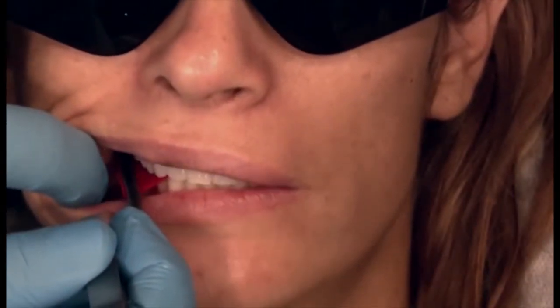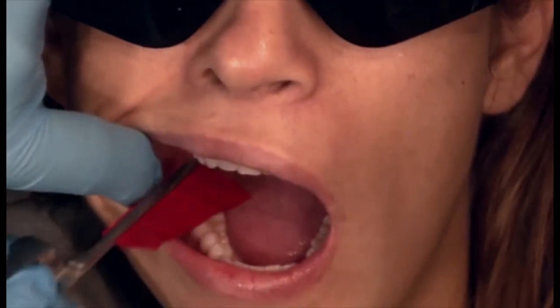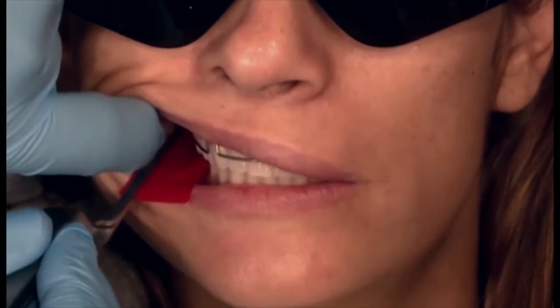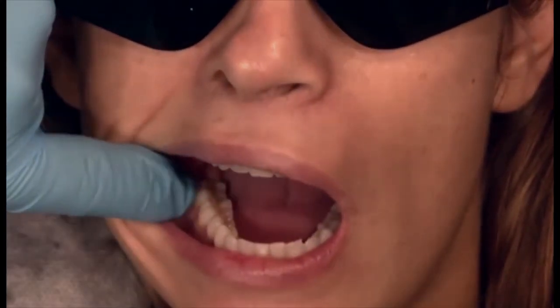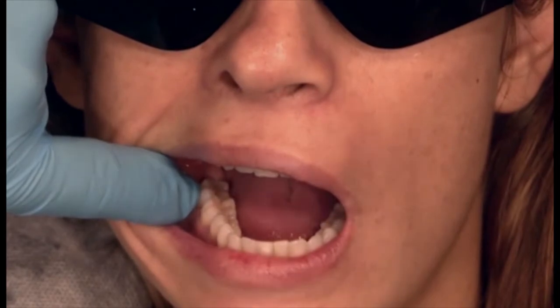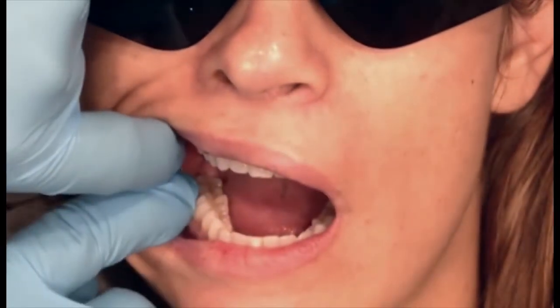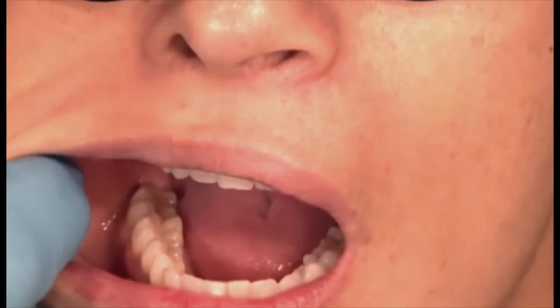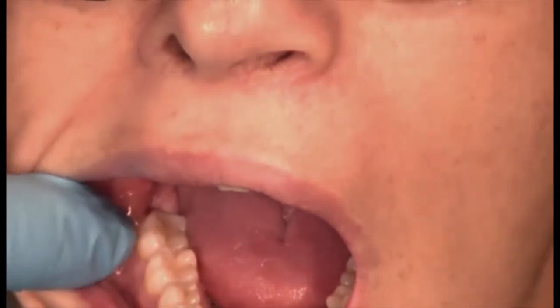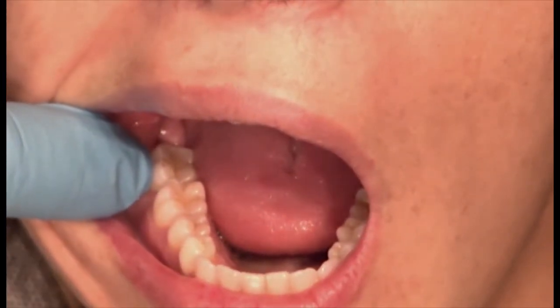Tap up and down. Open. Close. Stay closed. Open. And that's exactly where it is. So if you take a look, you'll see there's an initial point of contact right on that second molar.